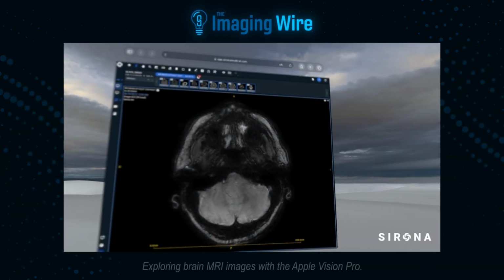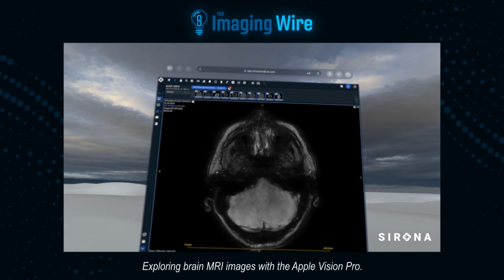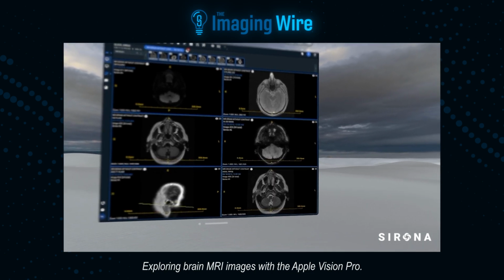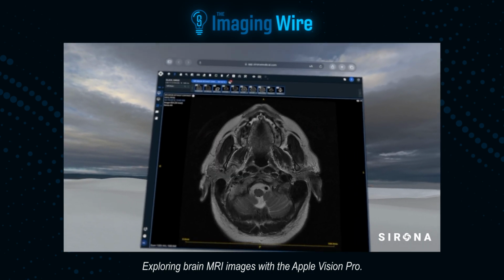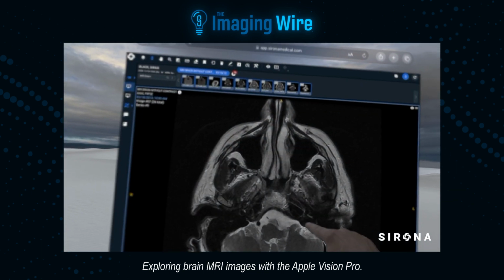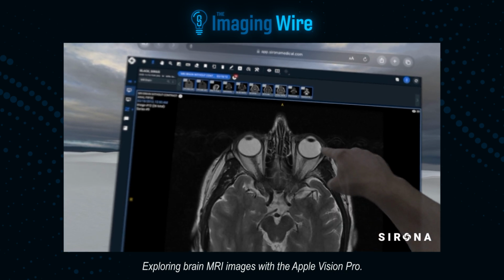Let's talk a little bit more about the eye tracking, because I was actually able to use one of these Apple Vision Pro headsets for the first time at HIMSS recently, and I didn't realize that it does have the eye tracking. I mean, it's looking at what your eye is looking at. When you put the thing on, you go through a little calibration test to see where your eyes are looking. And then from then on, as long as you've got the headset on, it knows what you're looking at. That puts it at a different level than just, like you mentioned earlier, looking at virtual reality in a headset.